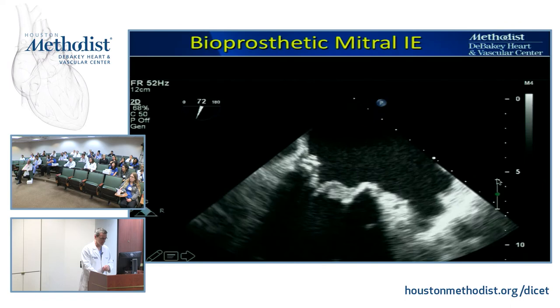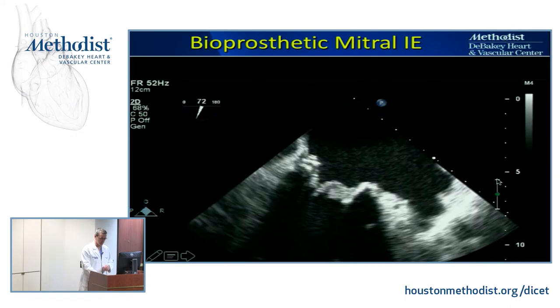This one is not happy. This one, I'll take this out. This is just a big veggie on a bioprosthetic valve. You can see it there, it doesn't need to play.